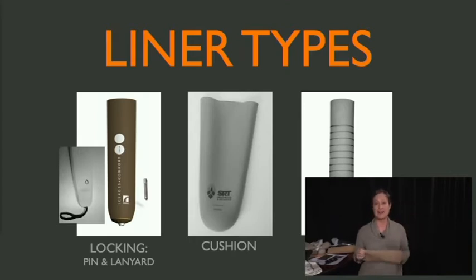And there's a liner that's called a seal-in liner. Again, there are several brands for each one of these. Don't get too hung up on this actual definition, but this is the language the prosthetist will use. And if you want to better communicate with them and understand what they're doing, then I think it's helpful to understand this language in general terms.